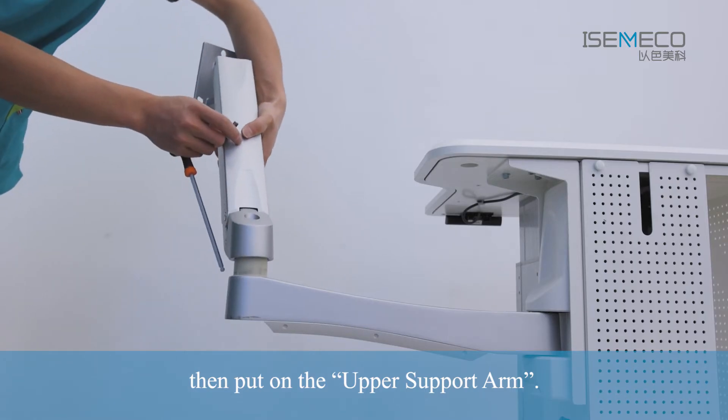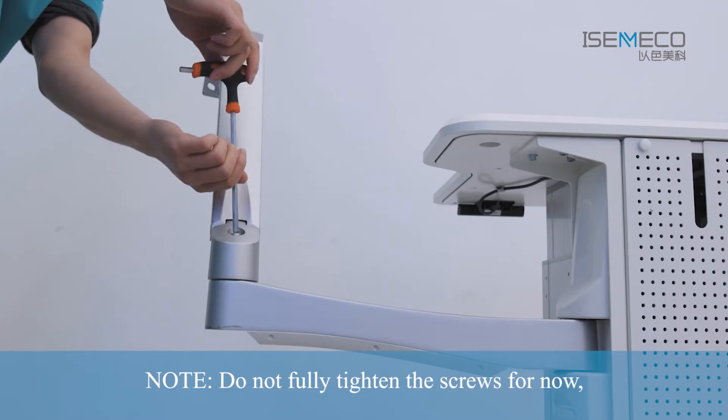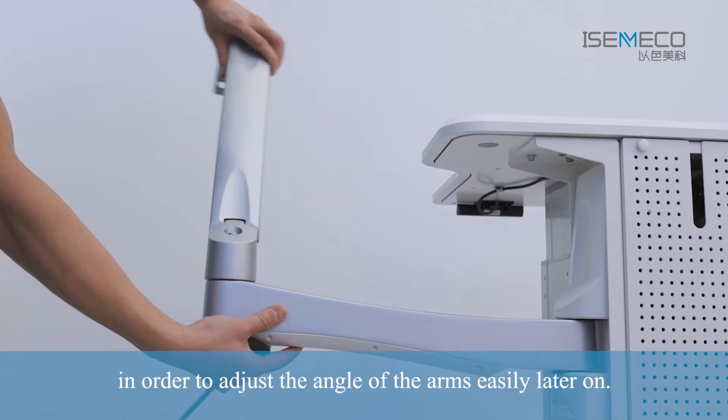Then put on the Upper Support Arm and tighten the large screw. Note: do not fully tighten the screws for now, in order to adjust the angle of the arms easily later on.